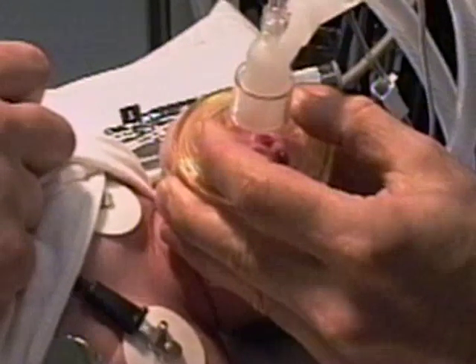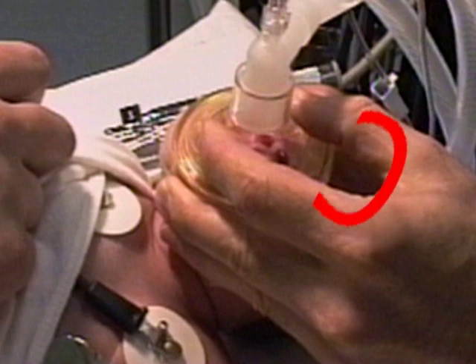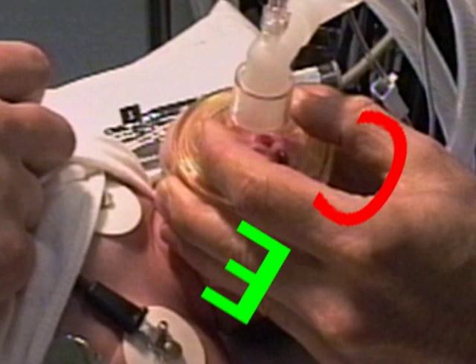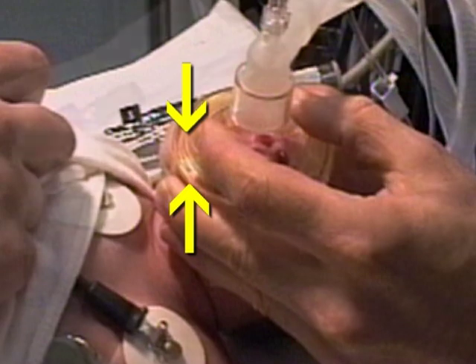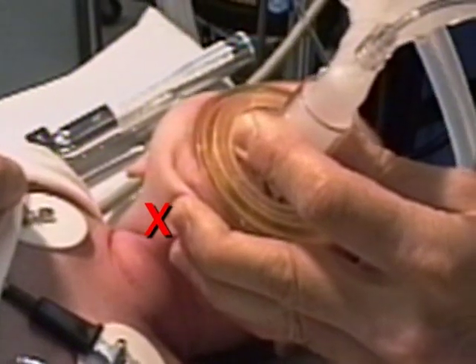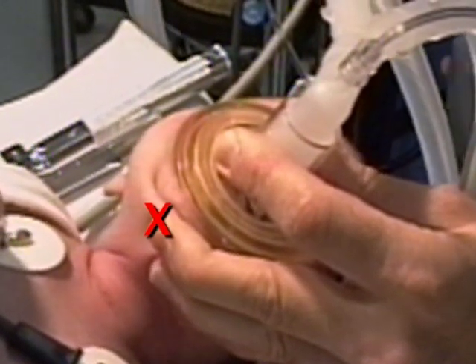Note the final position of the fingers. The thumb and forefinger press the mask against the face and form a C shape. The remaining fingers grip the bony mandible and pull upward, forming an E. The mask seal is created by the opposing force of the thumb and index fingers pushing down against the force of the last 3 fingers pulling up on the bony mandible. Don't press on the soft tissue under the chin because this can increase airway obstruction by pushing soft tissue in the epiglottis back over the laryngeal outlet.